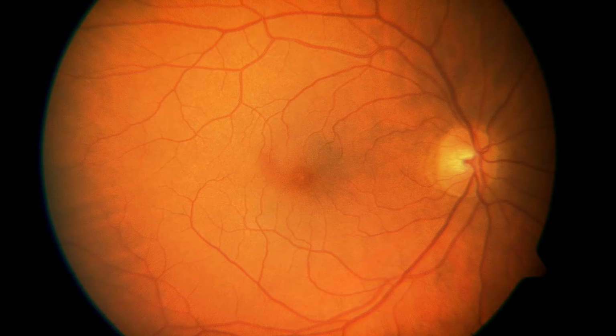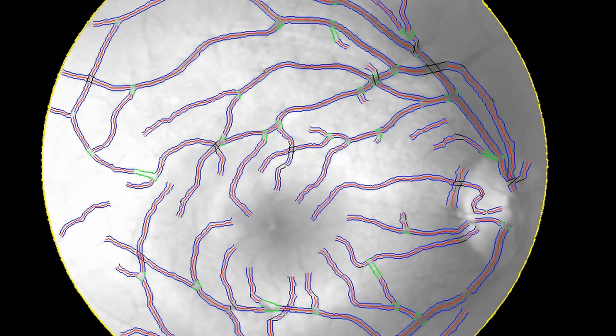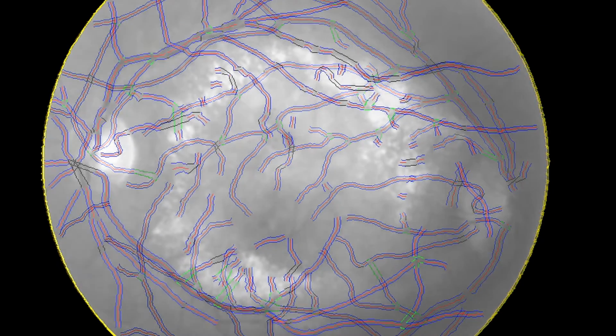We do something called retinal imaging. So you take pictures of the retina, the back of the eye, and then we take computerized measurements, we analyze these, and we're trying to correlate them with diseases to understand how they're developing.